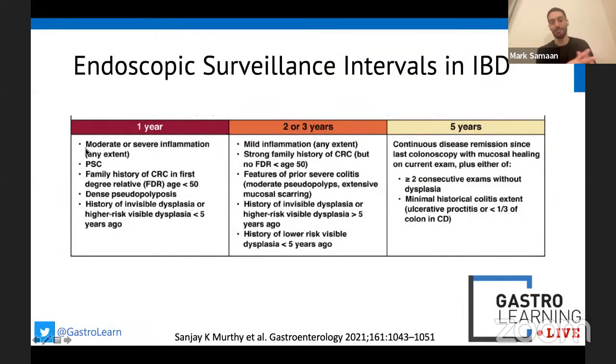And your other question was about what to do with those patients with dysplasia. That does depend on the grade of dysplasia, whether it was visible or invisible, and whether it's resectable. Usually what it comes down to is resect what's resectable and have an earlier follow-up, rather than 3 years or a year, maybe 6 months to have a look, and make sure that follow-up is done with someone who is, as you came back to, George, expert in dysplasia detection and removal, ideally.